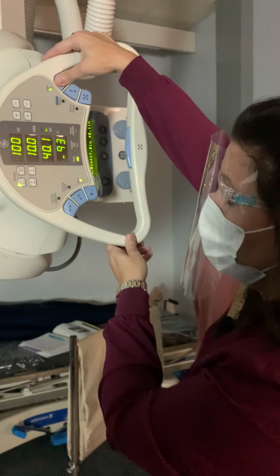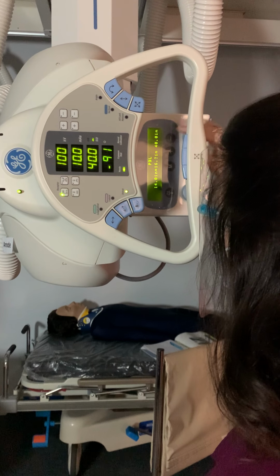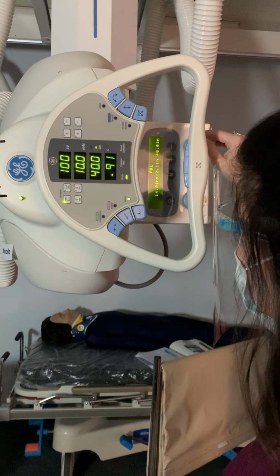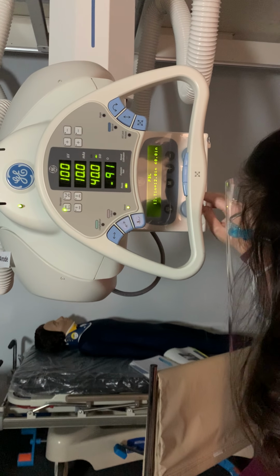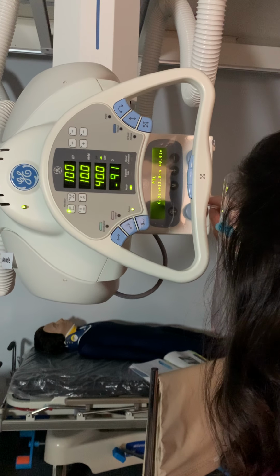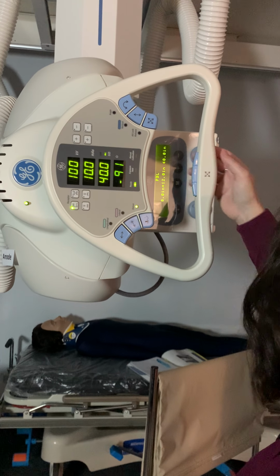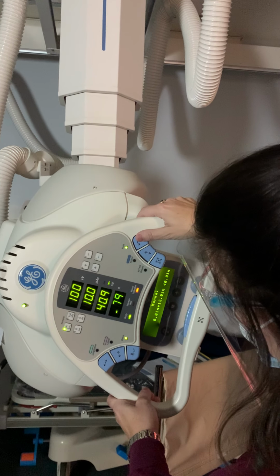So if we're at 90, but that's not what the numbers of 8 by 12 are when it's angled; they do not match up to an 8 by 12 collimation. Is it bigger? I'll show you. Let's do 8. All right, so that's my 8 by 12. And then I'm gonna go down to 75.